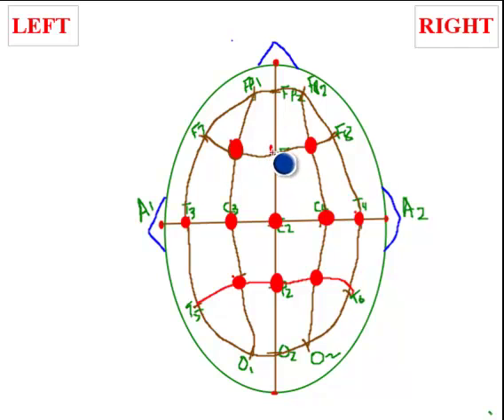This confirms location of Fz. You already have F7 here. You have F8 here. You have the Fp1 in this location, and Fp2 on this location.